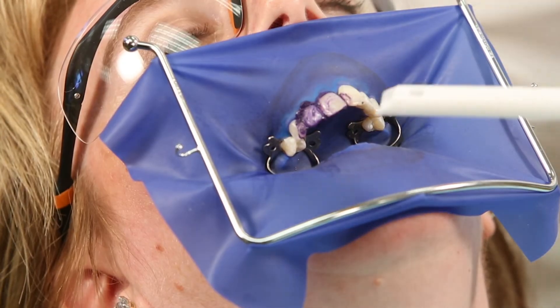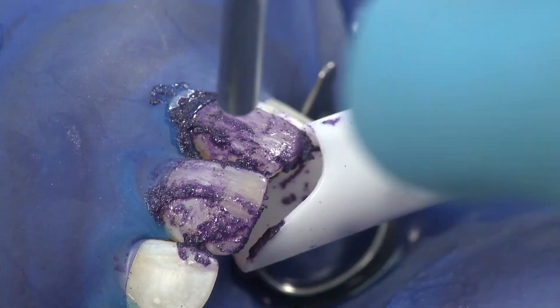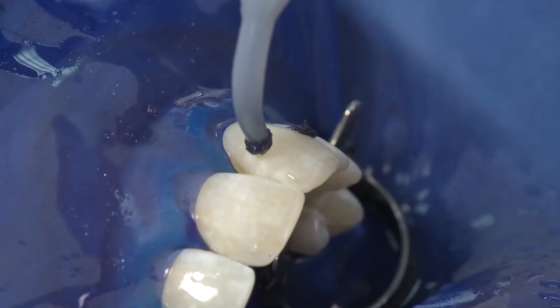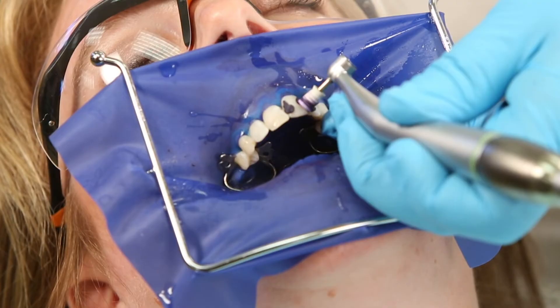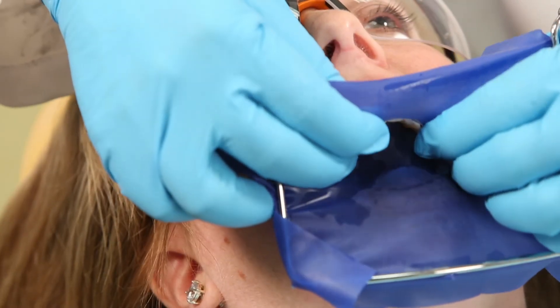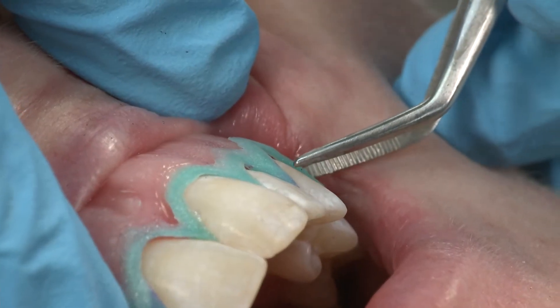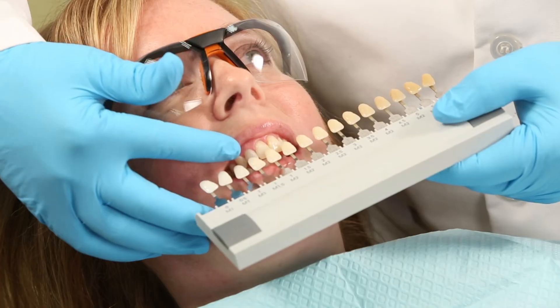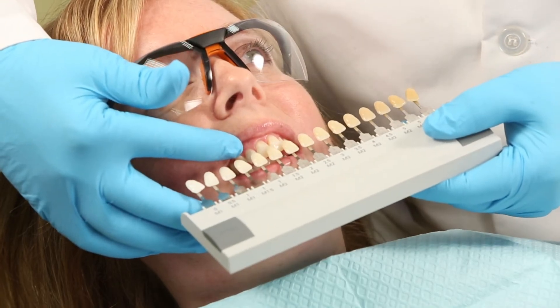Suction the paste from the teeth first, then rinse. Evaluate and repeat as necessary. Re-application can be conservative and limited to the areas requiring additional treatment. After the final rinse, remove the rubber dam and sealer from the teeth, then rinse thoroughly. Evaluate teeth and record the final shade.